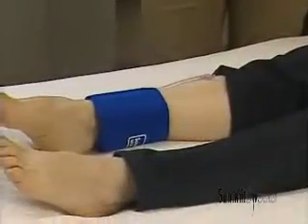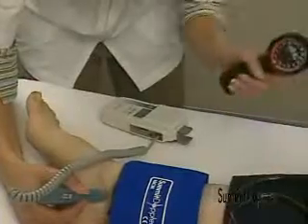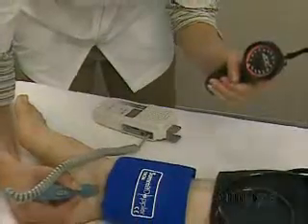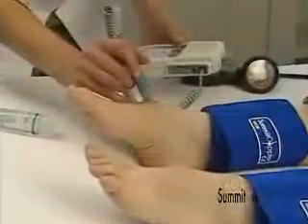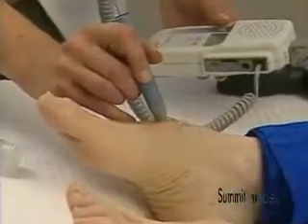Now we'll move to the right ankle. Before inflating the cuff, we'll acquire the Doppler waveform required for reimbursement. It is important to record the waveform before inflating the cuff, since flow dynamics may be temporarily altered after occlusion. In this example, we'll acquire a waveform from the posterior tibial artery. Later, we'll discuss using the dorsalis pedis for the ankle measurements as an alternate site.